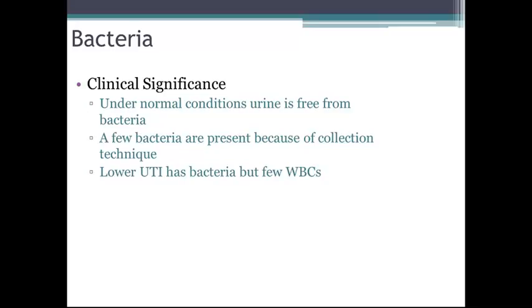So it's important to instruct our patients about the proper way to collect a urine specimen, a clean catch midstream urine, and the importance of wiping from front to back in 3 motions. A lower UTI has bacteria but will generally have fewer white blood cells present. An upper urinary tract infection will have bacteria but a lot of white blood cells present.